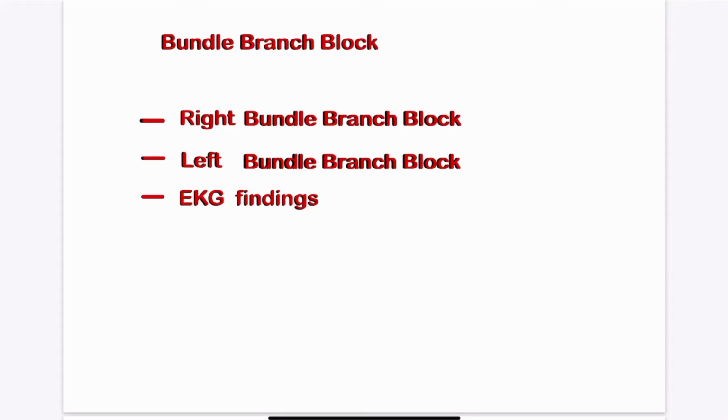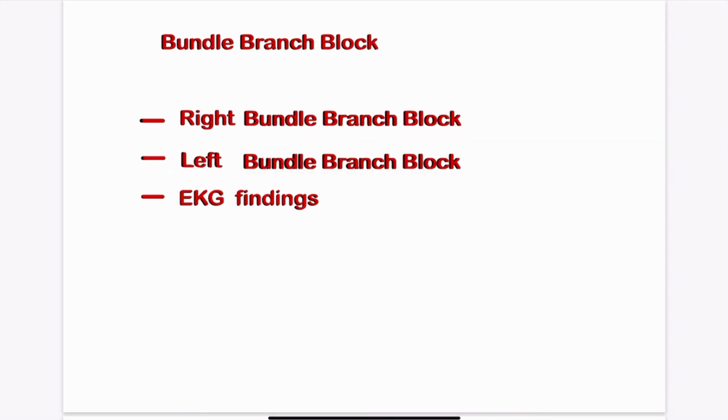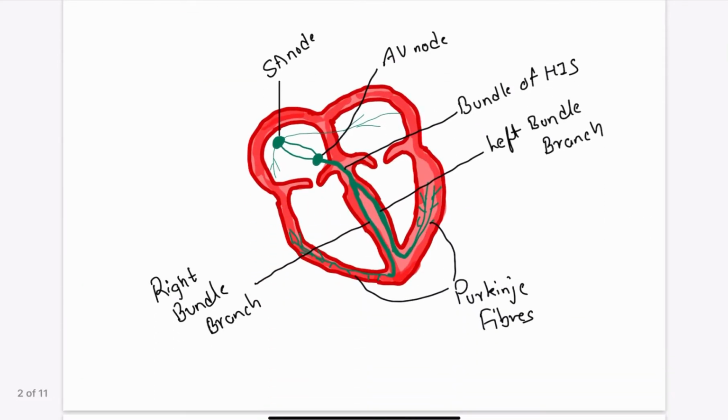Hello everyone, this video is about bundle branch block. I'll be talking about both right and left bundle branch block and also their ECG findings. So let's get started.